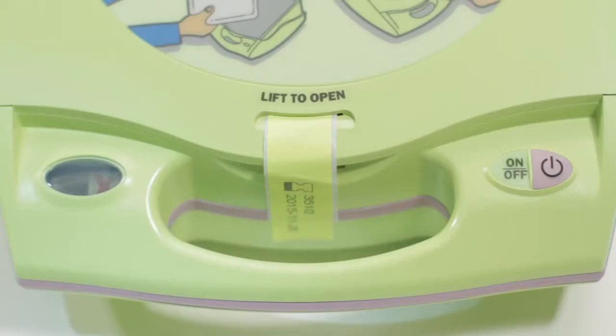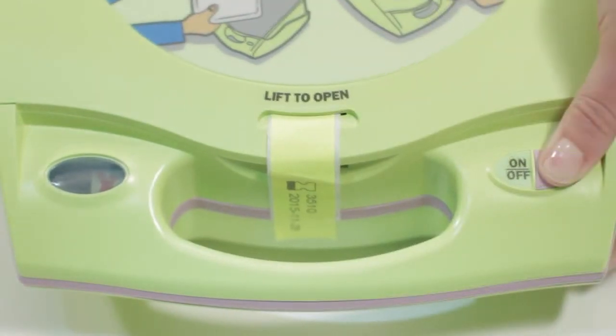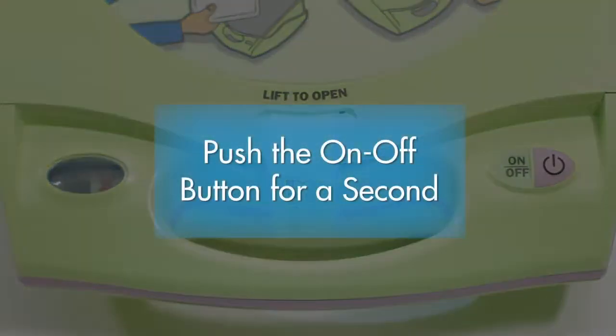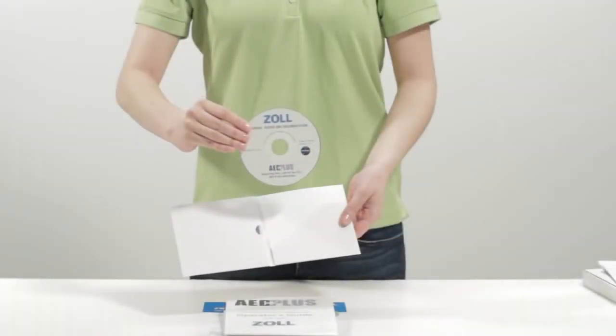If your AED ever fails a self-test, either automatic or manual, it will display a red X in the status window and will emit a beep on a regular basis. And if it fails a manual self-test, it will also say, Unit failed. If your unit fails a self-test, press the on-off button for a second, and the AED Plus will tell you what's wrong. Then check the troubleshooting section of your administrator's guide for solutions.